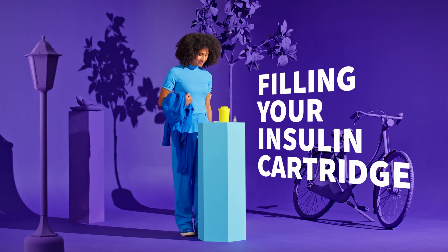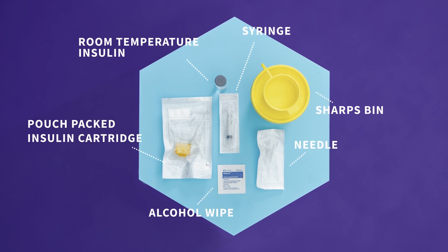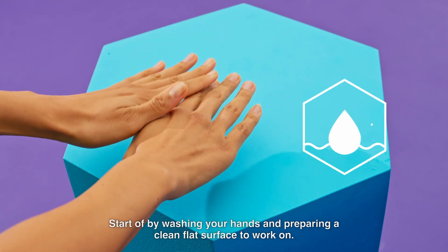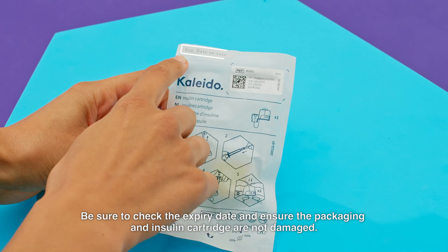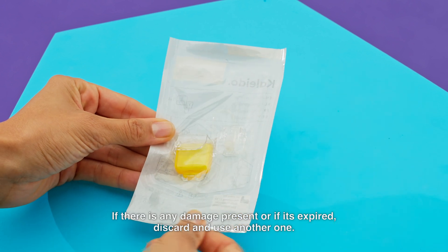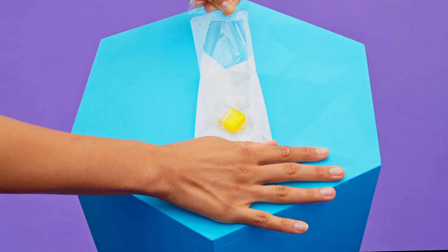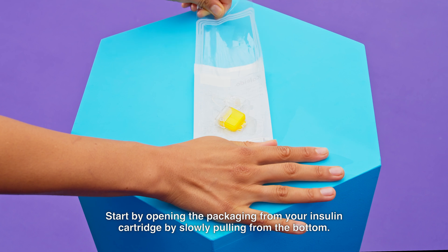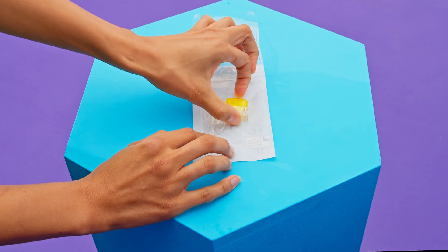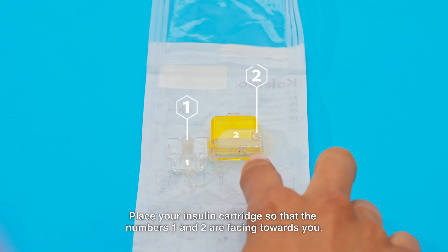Let's start by filling your insulin cartridge. Start by washing your hands and preparing a clean flat surface to work on. Be sure to check the expiry date and ensure the packaging and insulin cartridges are not damaged. If there is any damage present or if it's expired, discard and use another one. Start by opening the packaging from your insulin cartridge by slowly pulling from the bottom. Place your insulin cartridge so that the numbers 1 and 2 are facing towards you.